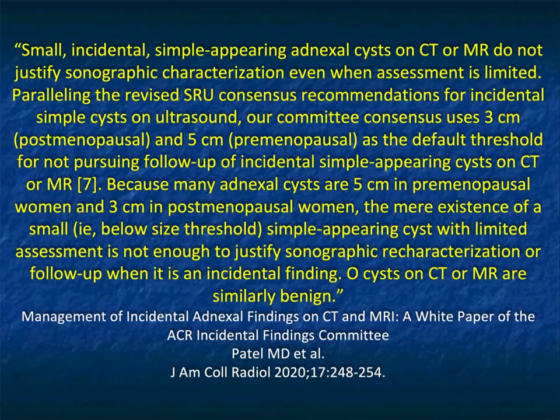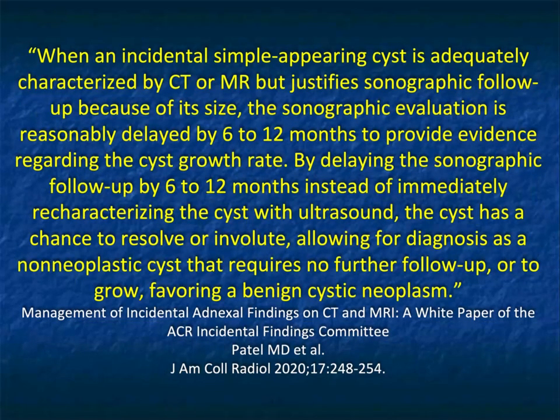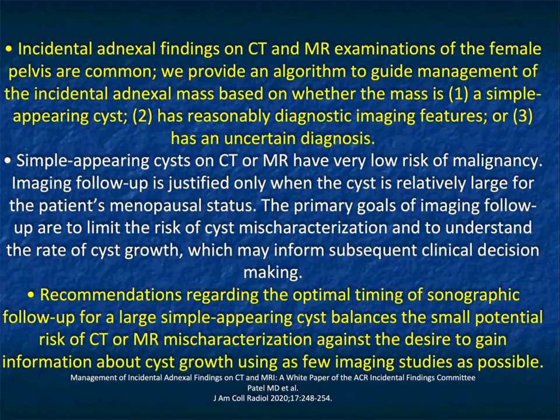Because many adnexal cysts are 5 cm in premenopausal women and 3 cm in postmenopausal women, the mere existence of a small, simple appearing cyst with limited assessment is not enough to justify sonographic recharacterization or follow-up when it is an incidental finding. So again, a very aggressive approach to say that you need to be conservative. Don't be working up all of these lesions. Very, very important. So again, some of the recommendations.